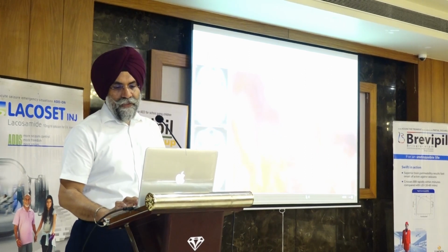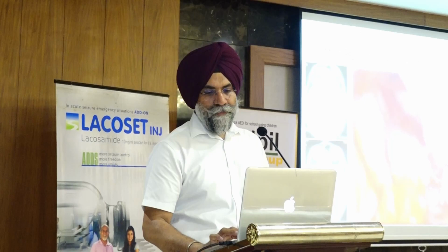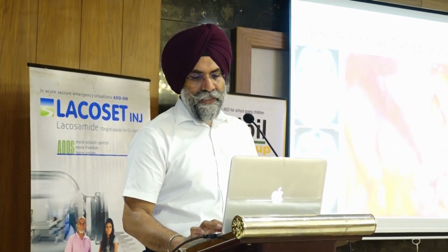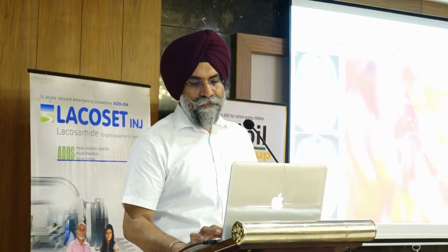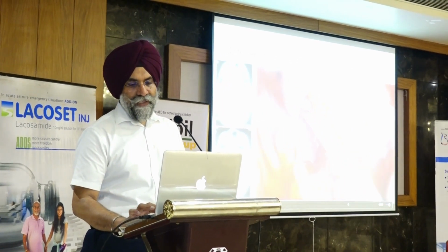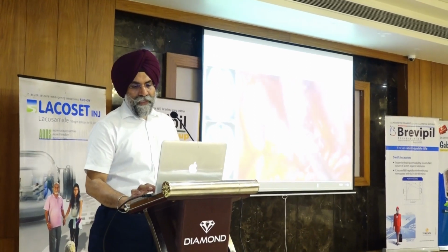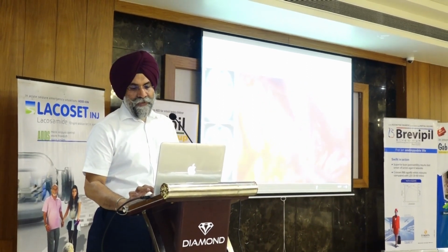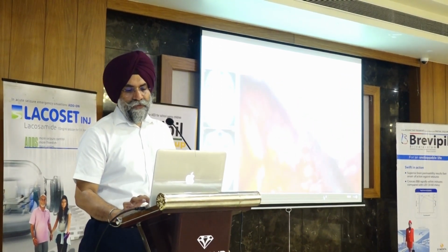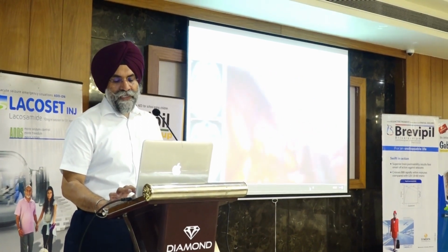So once that is done, the tumor cyst is decompressed, and the tumor is dissected all around. You will see the basilar artery and PCA come into the picture. These are the basilar tip, we can easily see. And this is the part which is actually going into the third ventricle from below, the interpeduncular cistern. So it is just pulled down. We are in control of the basilar tip.